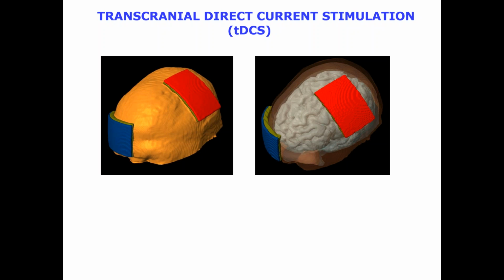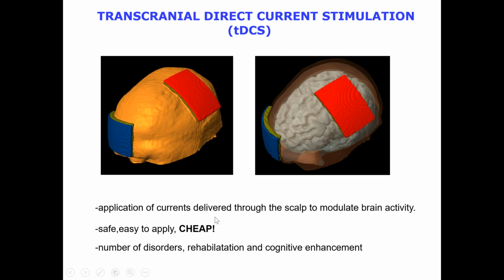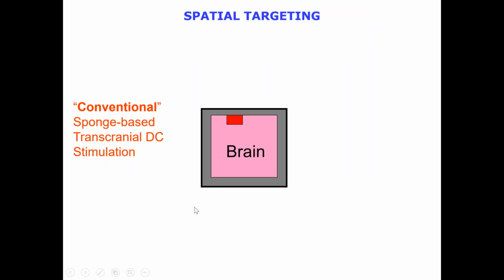And there's a very, very small current, and it's virtually imperceptible to the patient, usually around 1.5 milliamps. So to put that into perspective, ECT would use like 1,000 milliamps. This uses about 1.5. Usually there's 2, but this is a very common protocol where direct current is being put into the brain, and you modulate the cortical area that you're interested in.